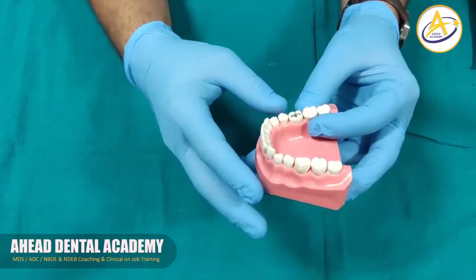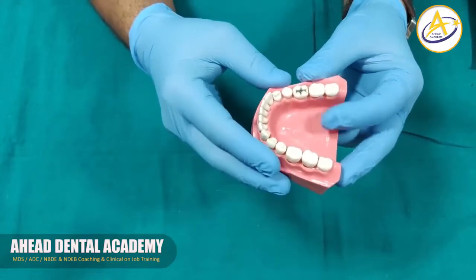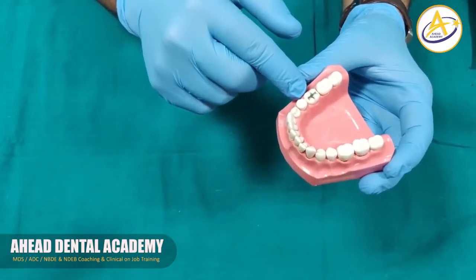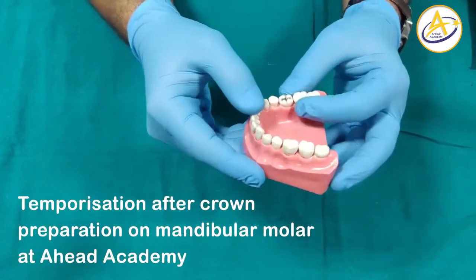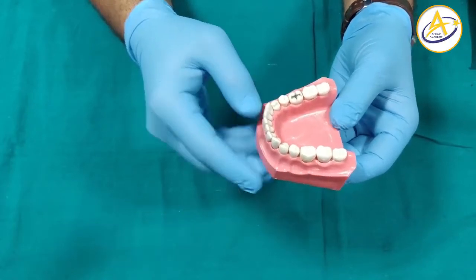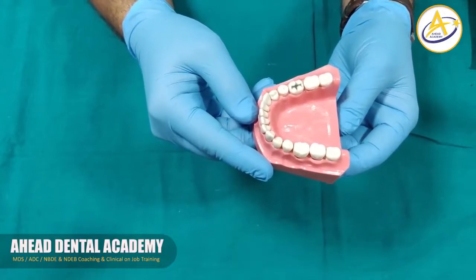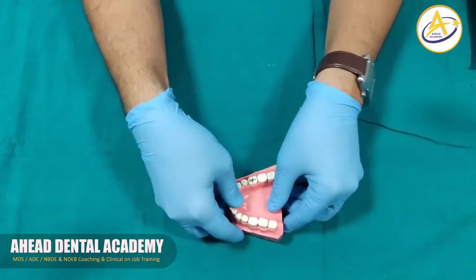of a temporization procedure that we can follow. As we can see, normally we get such kind of cases in which an RCT needs to be performed, followed by a crown which has to be given in this tooth. So for this purpose, before starting with the root canal procedure or with any kind of modification of the tooth, we make a putty index which we will be using for direct temporization inside the patient's mouth.